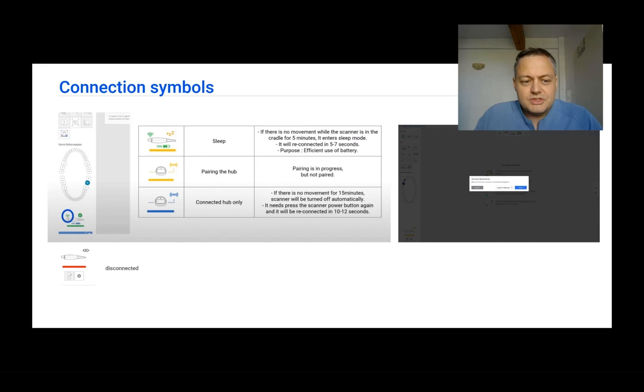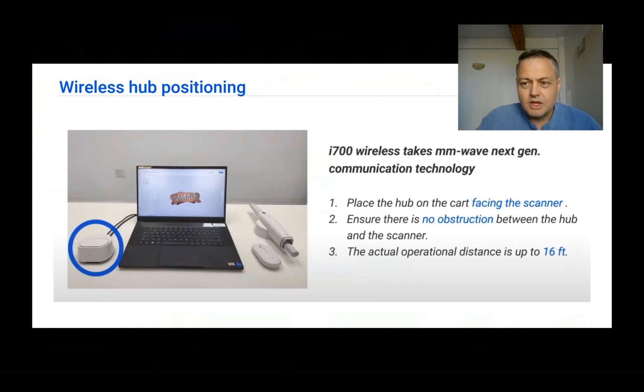Please watch these symbols on the lower left to understand what is happening with your device. One thing worth mentioning is that if you are using the i700 wireless, it uses a new antenna which is the actual hub. This antenna needs to face the scanner with the straight part towards the scanner and must not have any obstructions. So please try to place the antenna towards the chair and the patient sitting there.